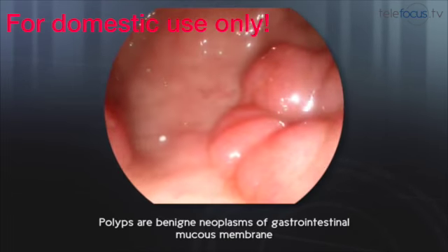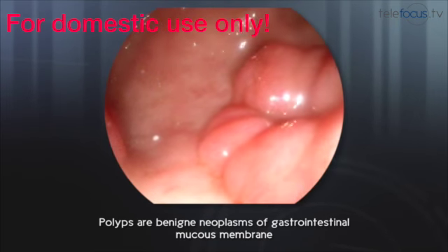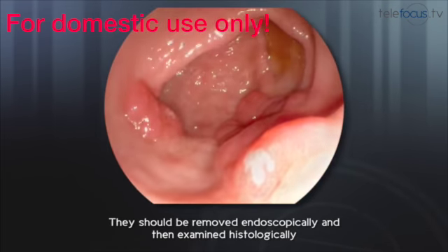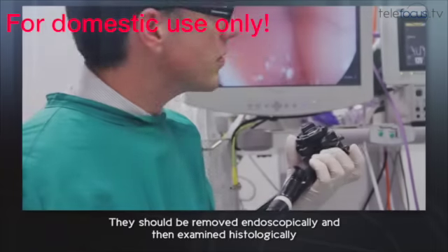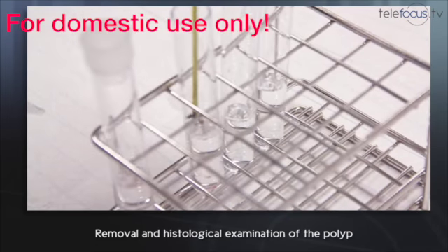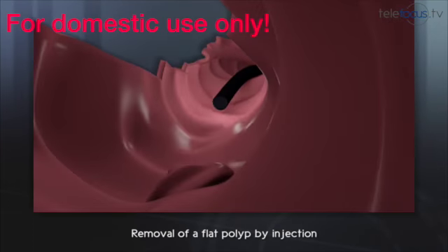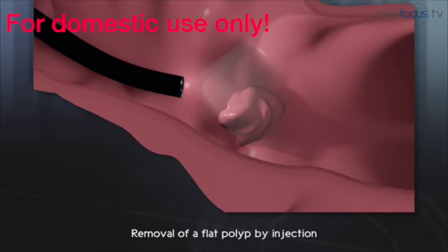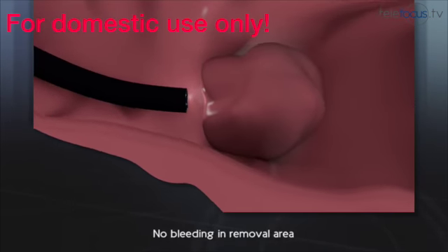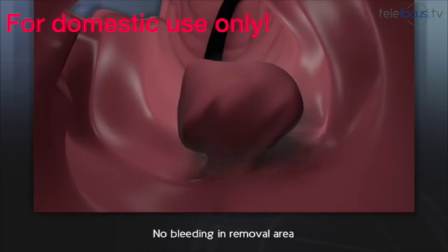Elderly people commonly develop polyps. These are benign neoplasms of the mucous membrane. Polyps are harmless, but in some cases they might be a primary stage of stomach cancer and should therefore be removed endoscopically and be examined histologically. After injecting a drug, flat polyps are lifted and can be removed by using an electric loop. The area won't bleed after that.